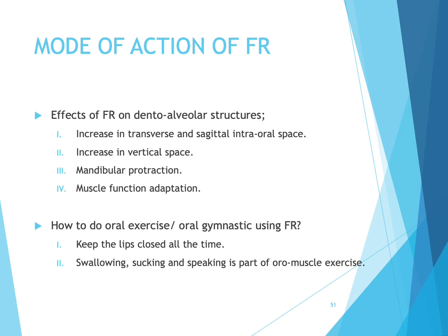Frankel also recommended certain oral exercises called oral gymnastics. Some of the exercises recommended are to keep the lips closed at all times. This can be aided by asking the patient to keep a piece of paper between the lips. Then swallowing, speaking, and so forth become more or less an exercise when the appliance is used.